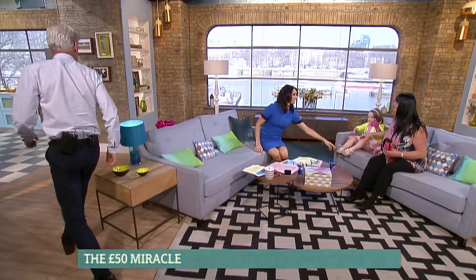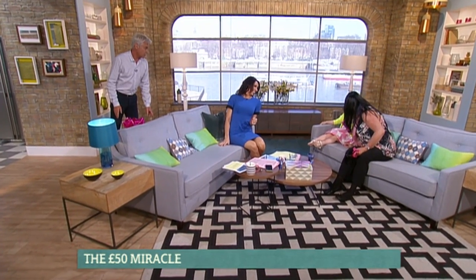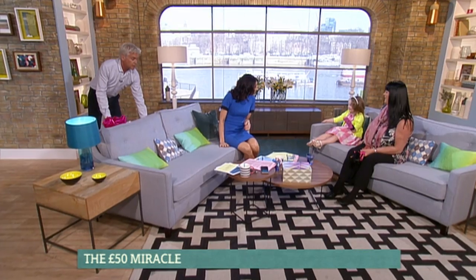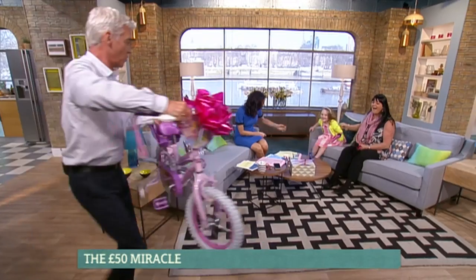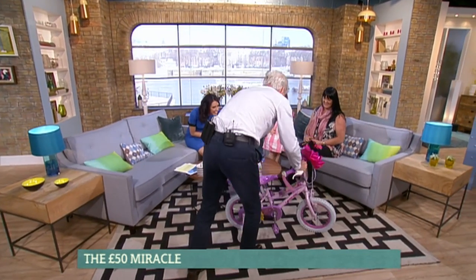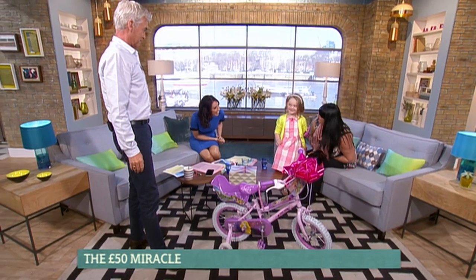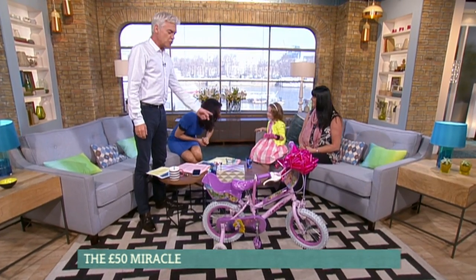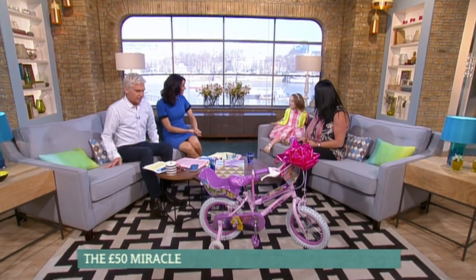From us, we thought you might like an early birthday present — is that alright? Would you like that? I'm going to bring it round here for you. There you are, that's your birthday present from us. Oh, thank you so much! You can have your first practice run on it in a minute. Happy birthday from us!